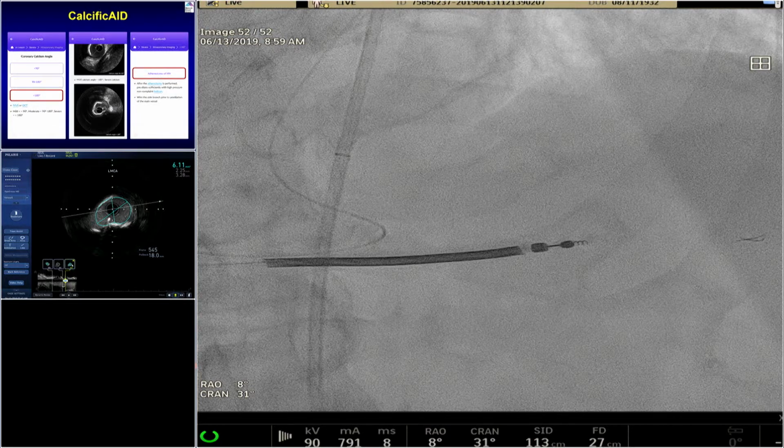What they have is a Dyna button. You press the Dyna button and Dyna gets activated. This is the Dyna button. Can you show the hands? Yes, we see your hands.